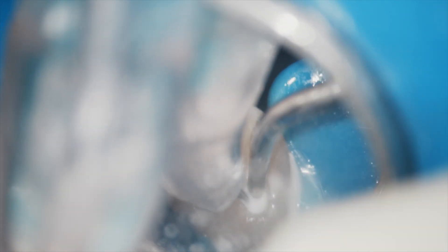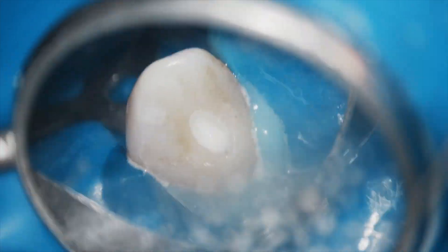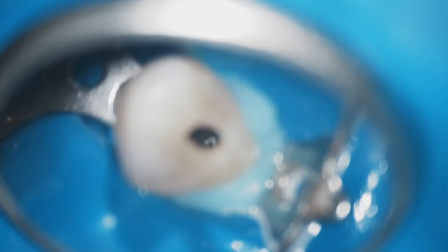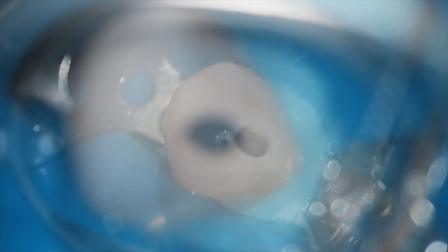This idea of irrigation and suction simultaneously — the Total Vac in mode one, with the short tip and its activation along with the ultrasonic — can really catalyze the whole process of working through the calcification. Now you can see it has actually removed all of that calcification. You can see a tiny hole there — that's the little opening that was present just beyond the calcification at the apical area of the tooth. It's important to ensure none of the calcification has fallen into it.